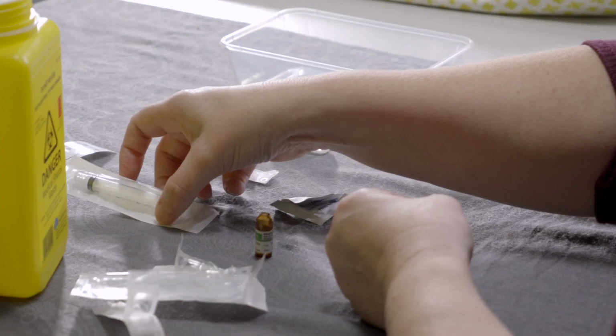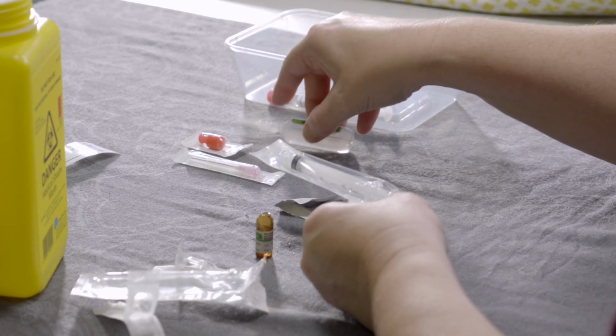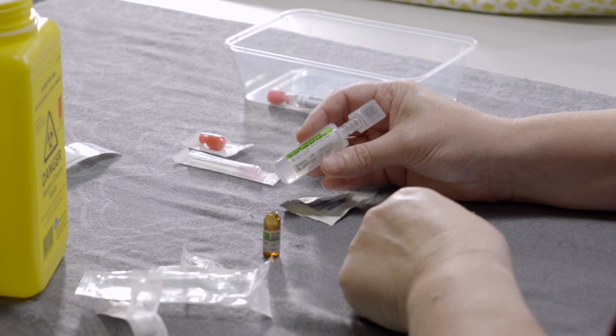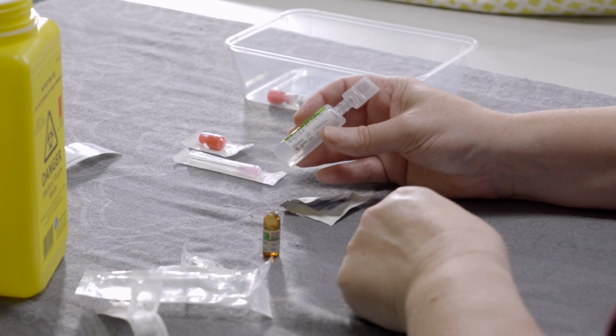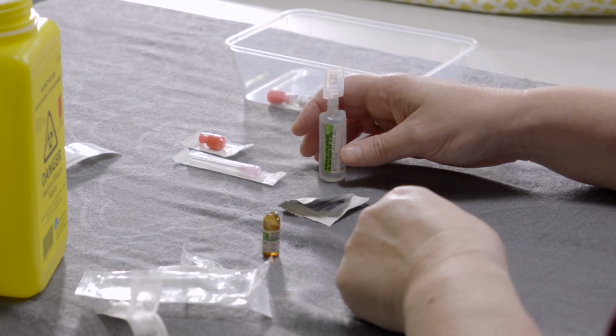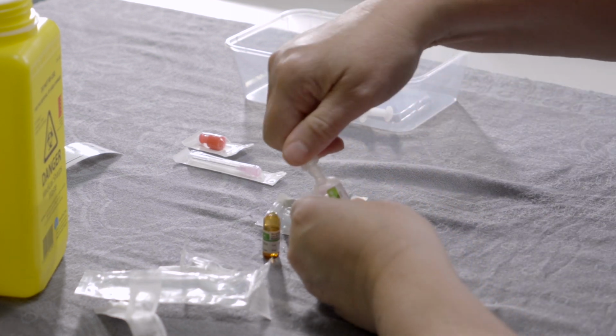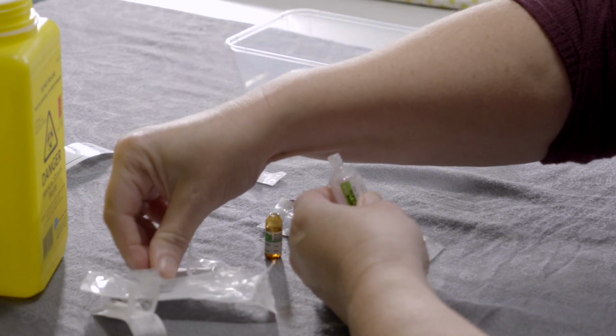Finally, you need to draw up the flush. Flushes are needed to ensure the whole dose of the medication is given. For a flush, we use sodium chloride or water, which comes in a plastic ampule. Your palliative care team will determine which flush is needed, depending on the medication to be given. To open the plastic ampule, twist the top to take it off.